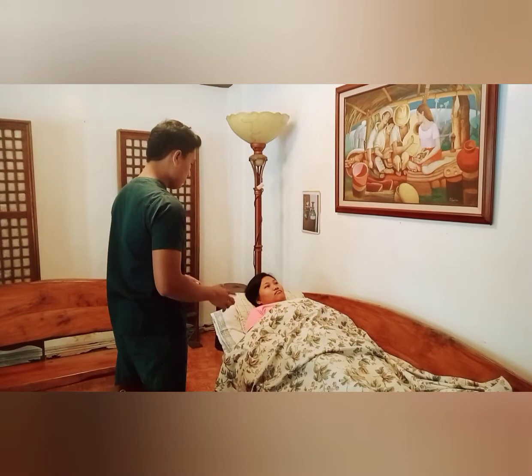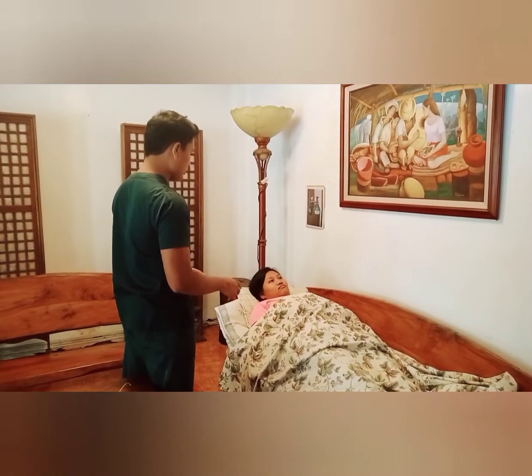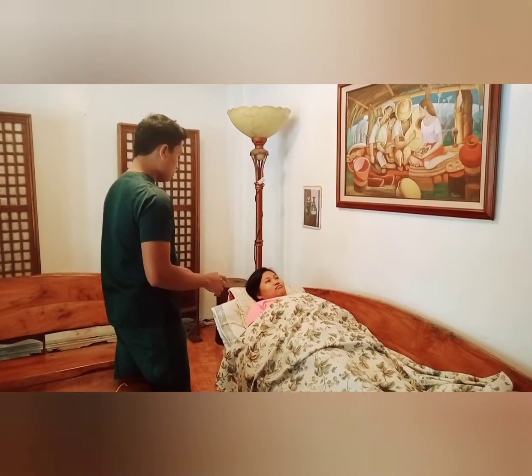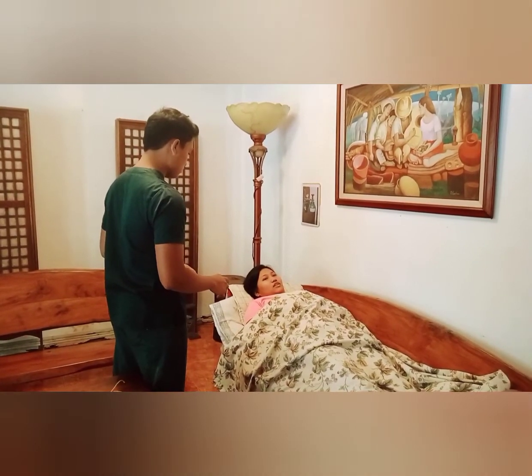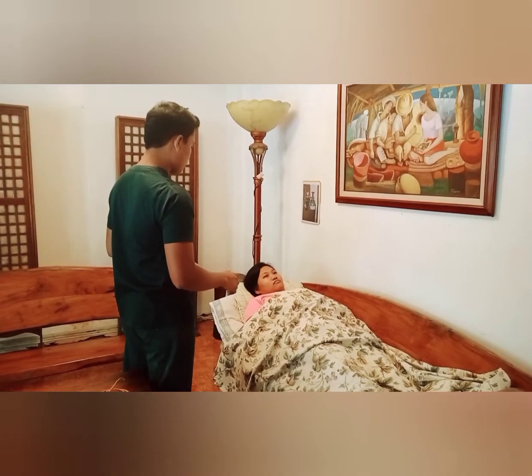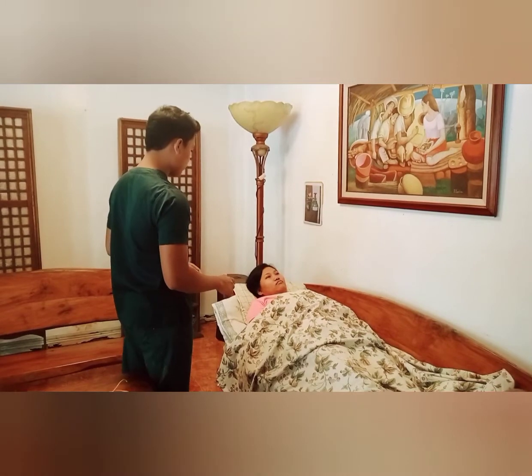Good day, ma'am. My name is Janich Morales, and I'm your caregiver for today. Today, I will administer your oxygen by nasal cannula. Is that okay with you? Yes. So, thank you, ma'am. How is your day and how are you feeling? I'm good. Okay, so that's good.